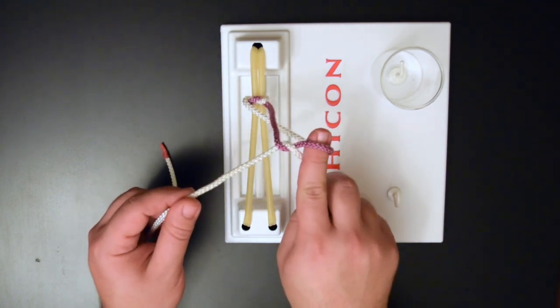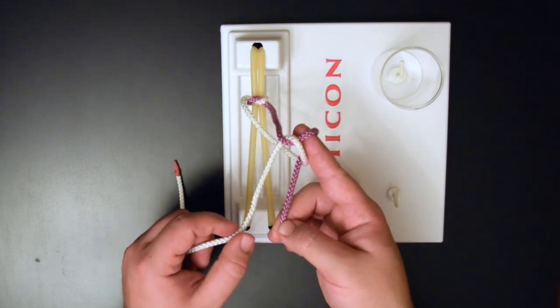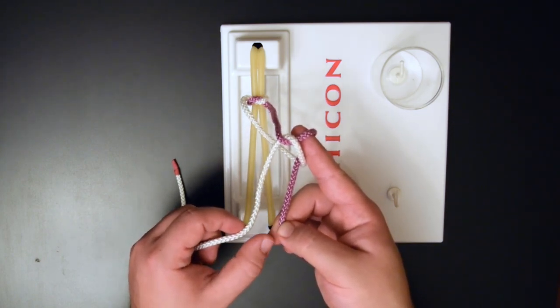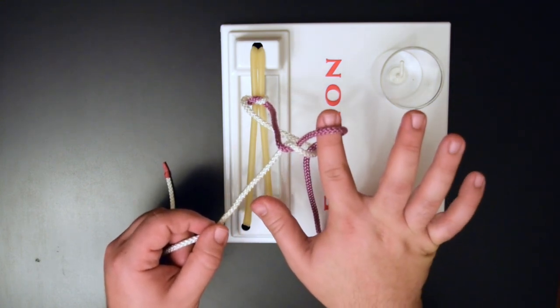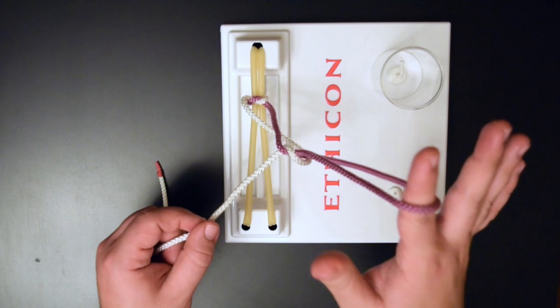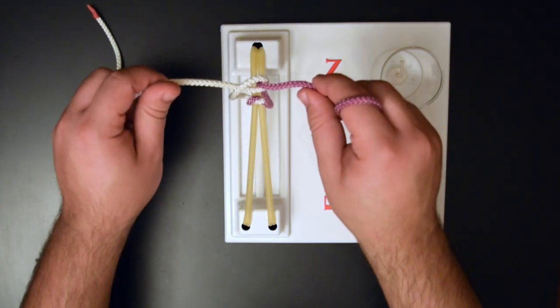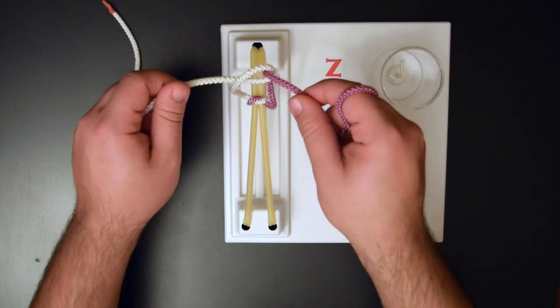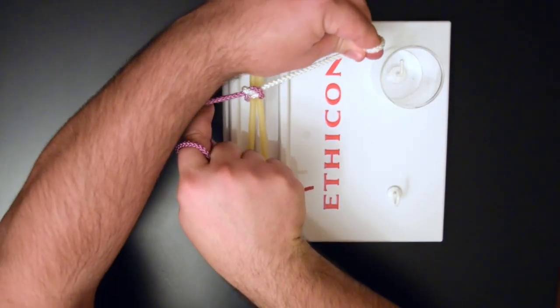As you rotate your hand out, let go with your middle finger and your thumb. Rest the suture on the back side of your index finger and pull it out. Note that if you pull in the wrong direction it's going to twist your knot, so you want to turn your hands to get nice square knots.